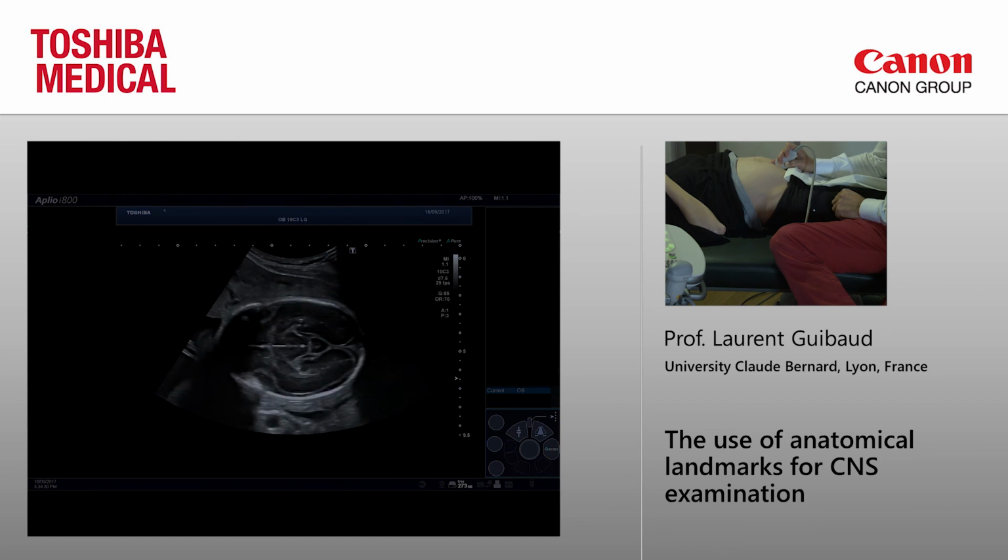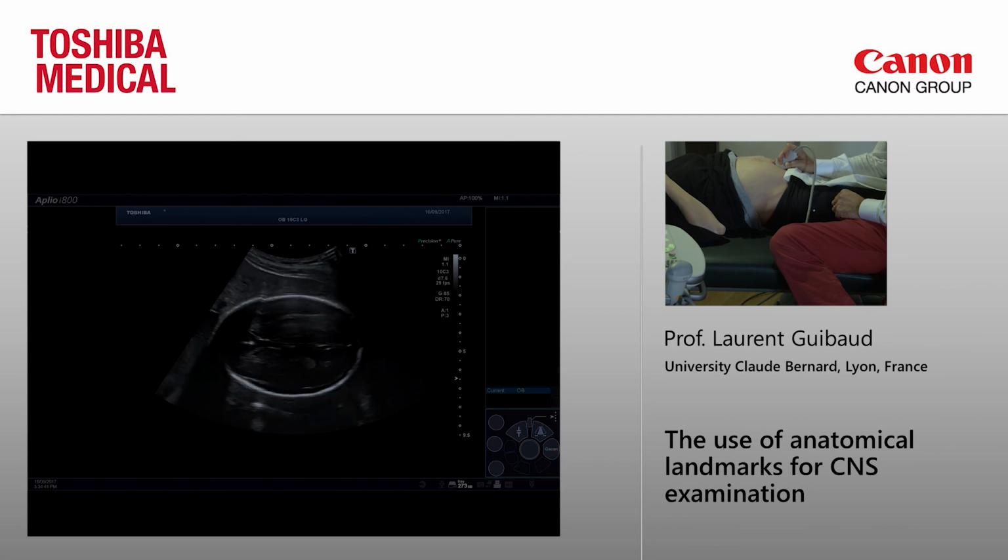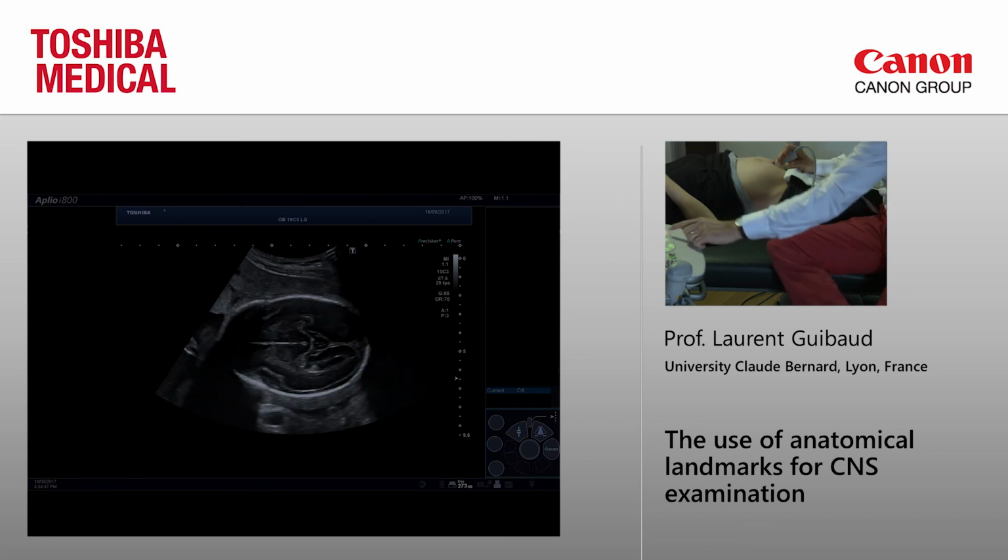And this is very important, and the midline is at equal distance from the two vaults. And if you want to know where you have to measure, we say that it's important to have two landmarks. Here you see clearly that you have, okay, thank you.